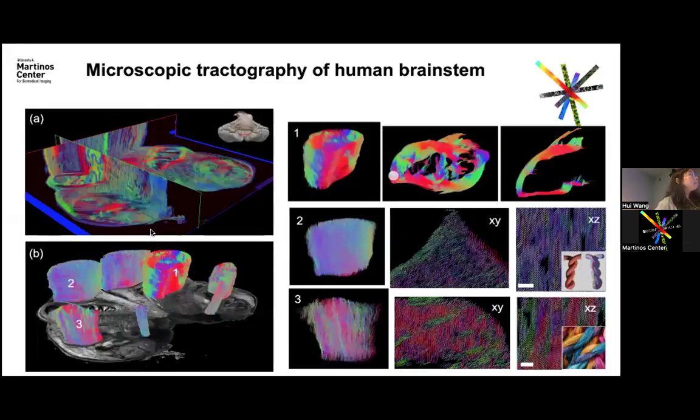So I'm saying that in regular tractography, you would be used to seeing a consistent color for those tracks that belong to the bundle. And here you see the colors still indicate the direction? Yeah, they do. It's the traditional diffusion tractography color, like RGB.